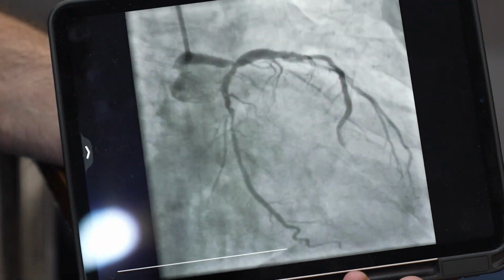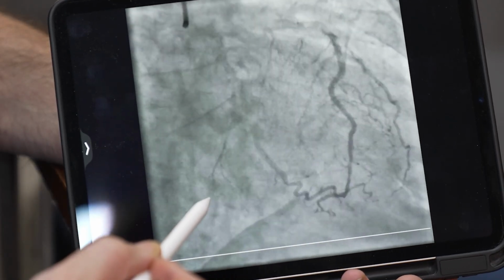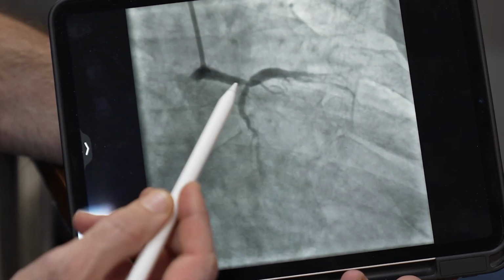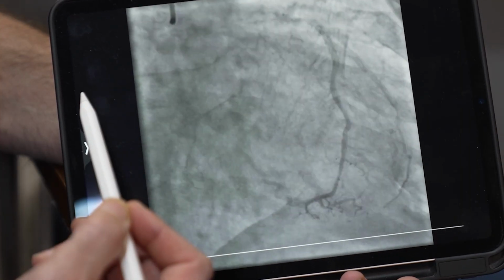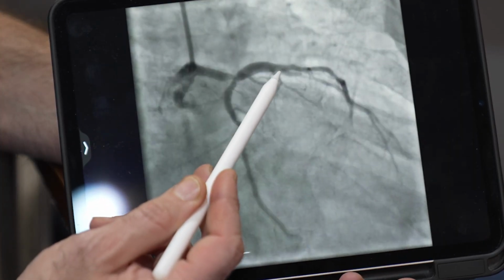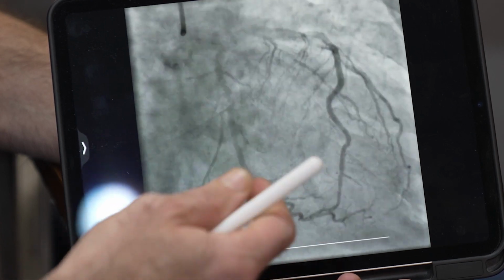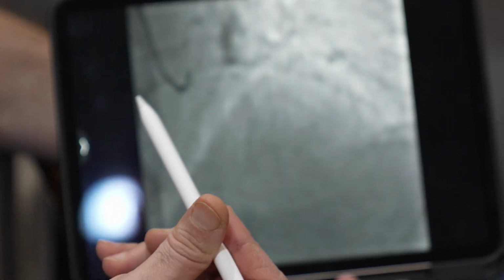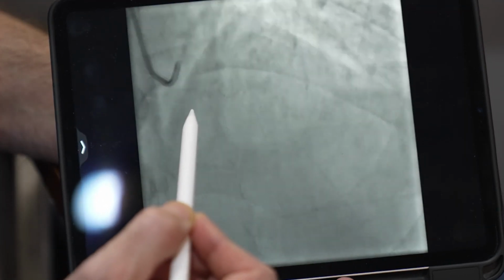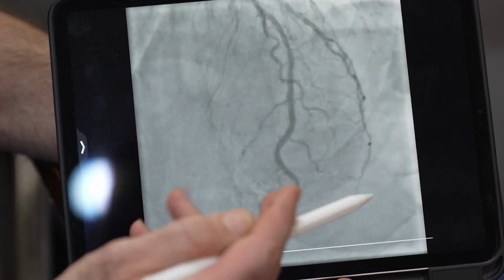So it's clear, this is the angiography, diagnostic angio done with radial approach: distal left main stem, critical lesion, involving the ostia of both the circ and the LAD, and there is some aneurysmal dilatation of the LAD. And the circ, there is some critical lesion. If you go for the cranial view, there is some intermediate lesion in the LAD that we need to address during the PCI.